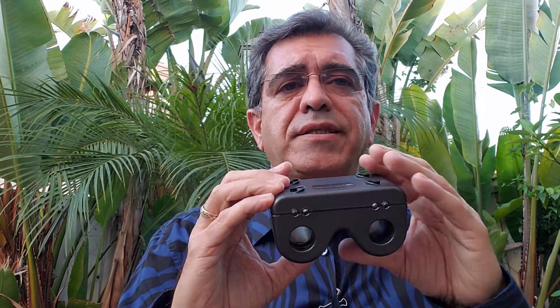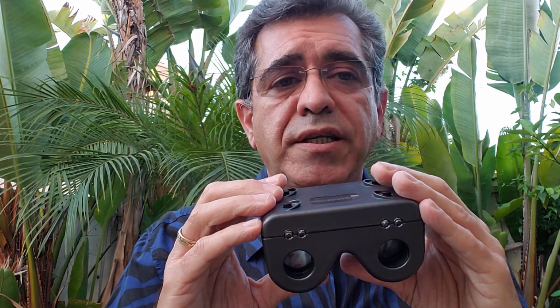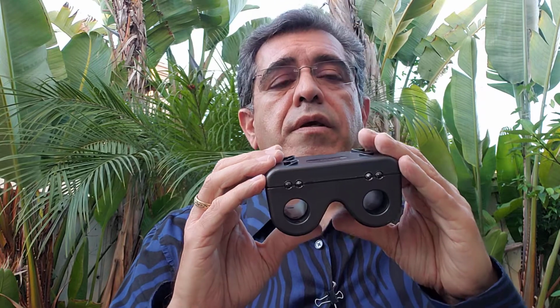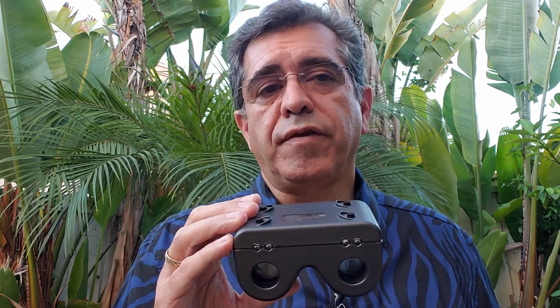If you happen to see one pupil dilate slightly after you switch the light, that would be a positive APD. It would mean that the eye that dilated must have an abnormality. It's either in the optic nerve or a significant portion of the retina.